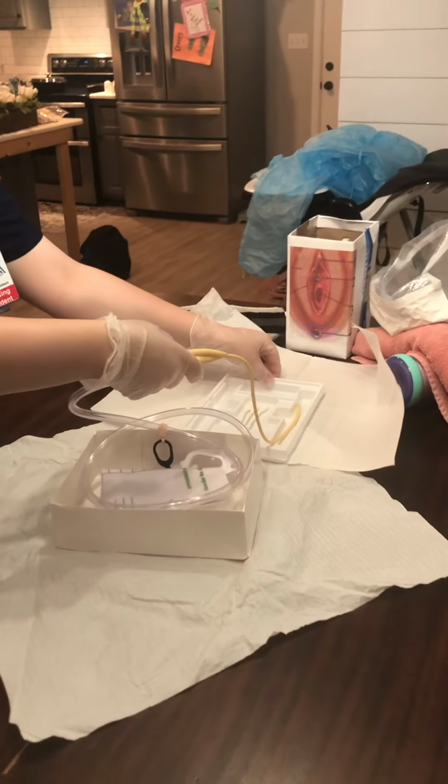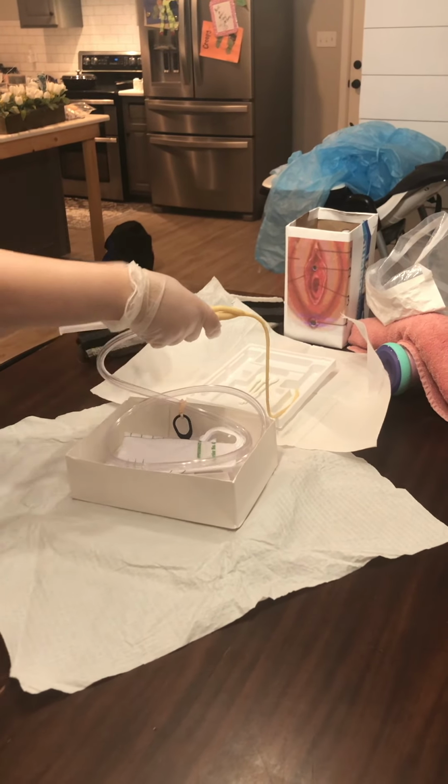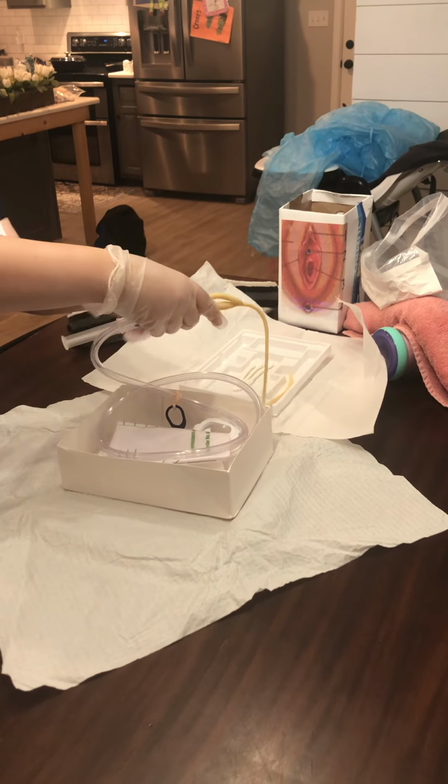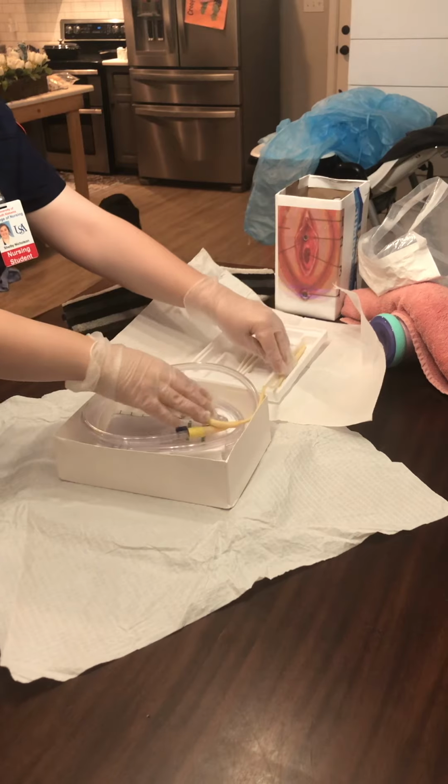Okay, so I'm going to scoot everything closer to the perineal area. Okay, I'm going to lay that down.